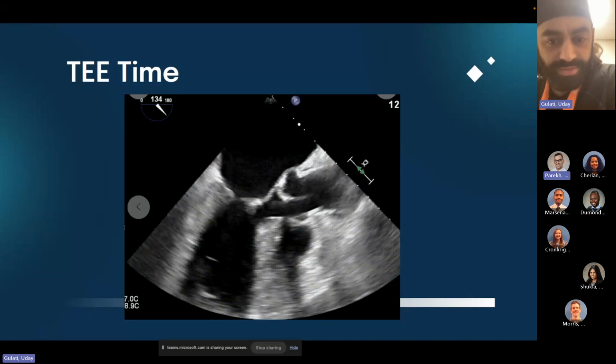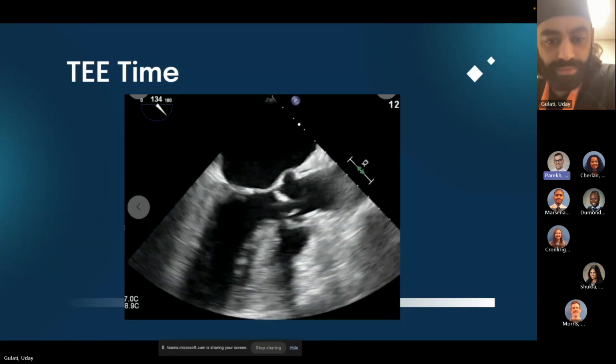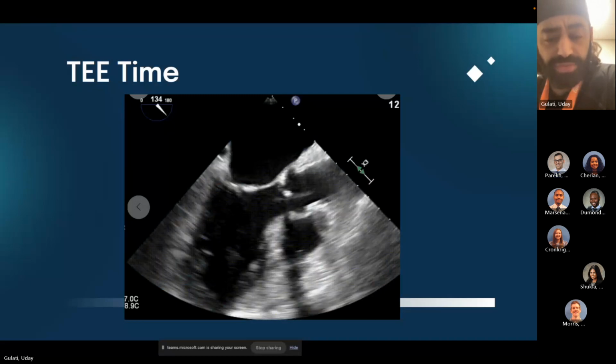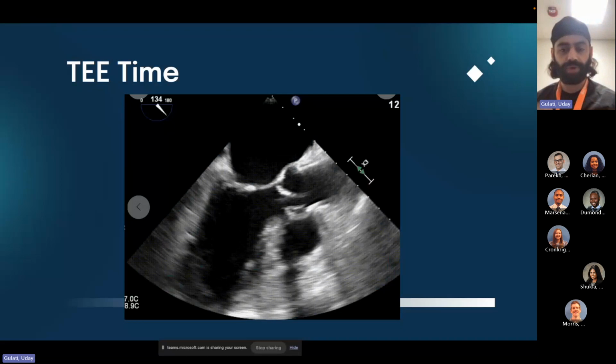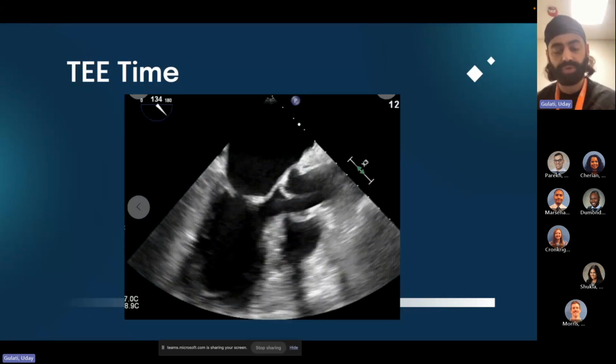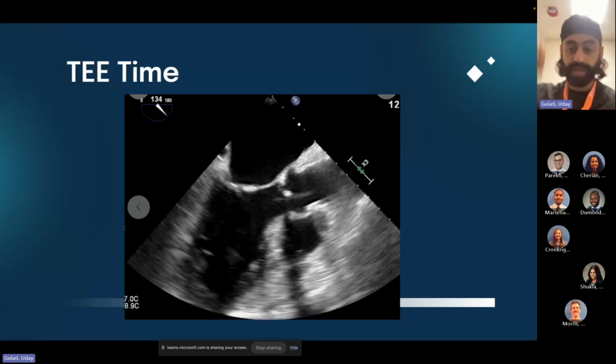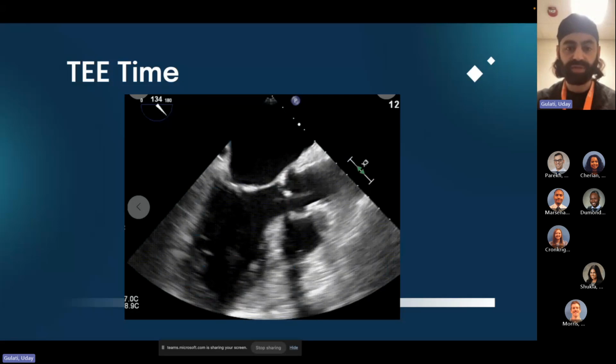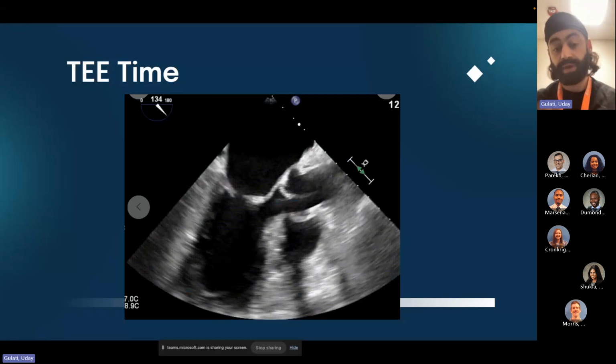Yeah, this is that inverted parasternal long, with the right ventricle being furthest away from the probe. What I would say is that you still want to clarify, when you're doing sign out for this, or when you're letting another provider know what view you're in, both anterior and how advanced or withdrawn that probe is. So I would say this is mid-esophageal, usually around 12 centimeters, and then parasternal long.